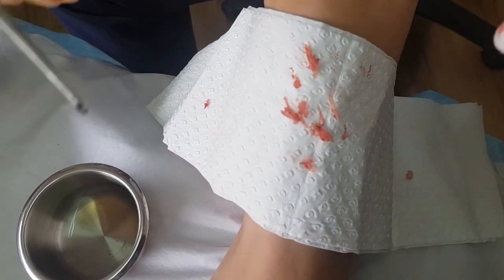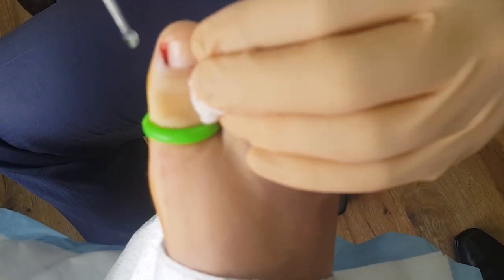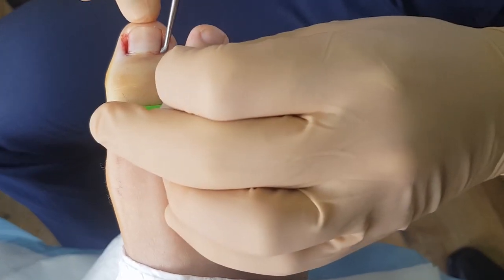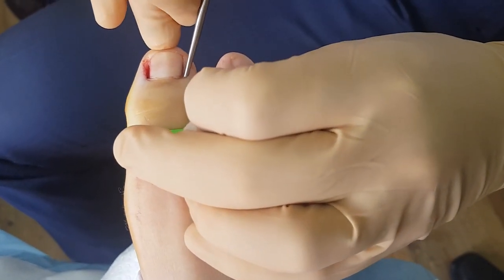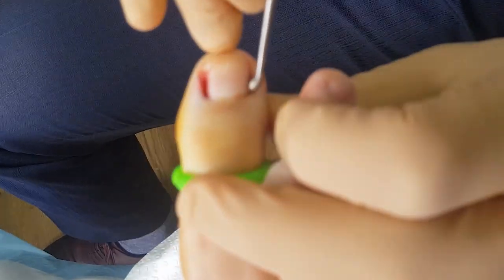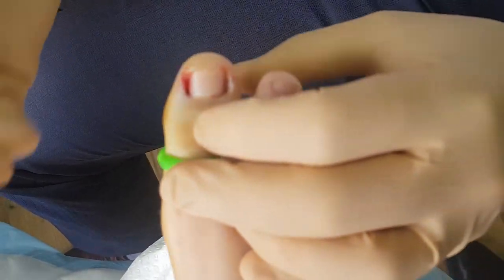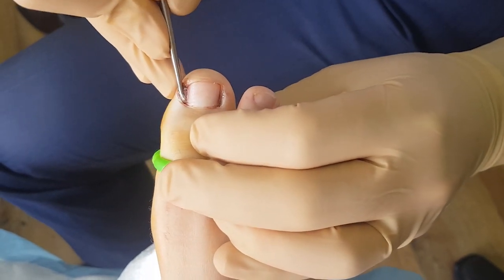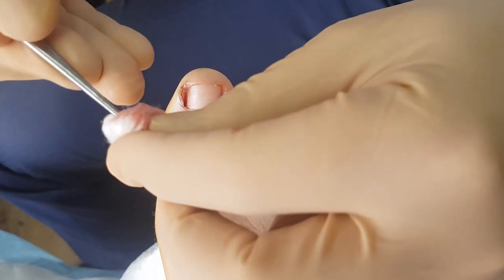So you can use a curette to apply the phenol. We're just going to pop it down near the germinal matrix on both ends and let that act there. Dry up any excess.